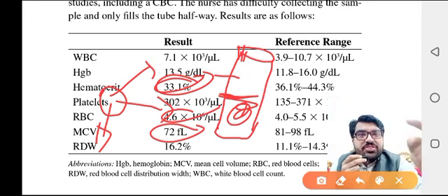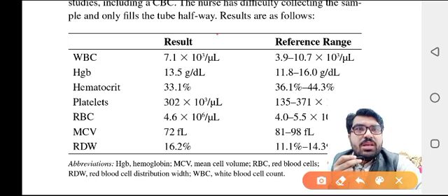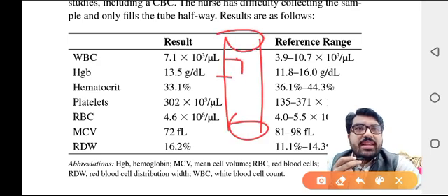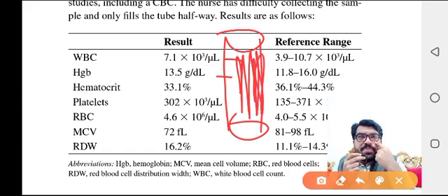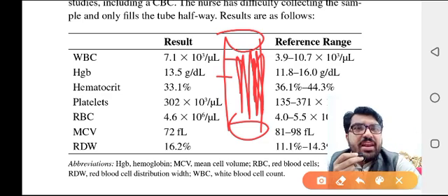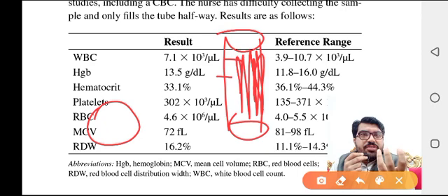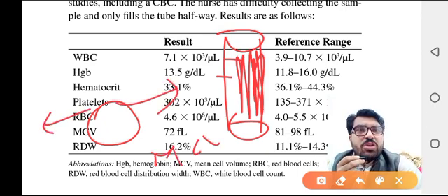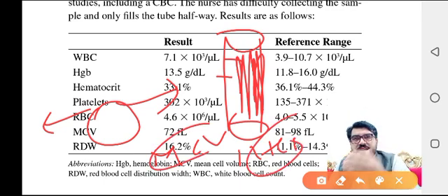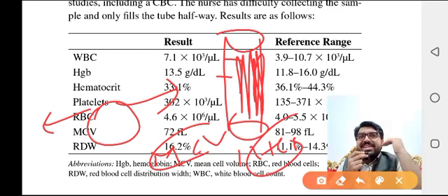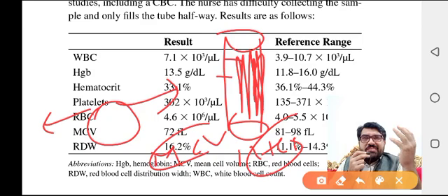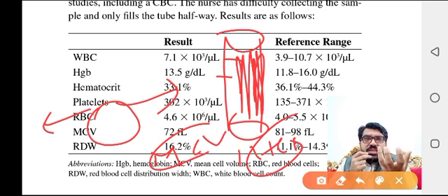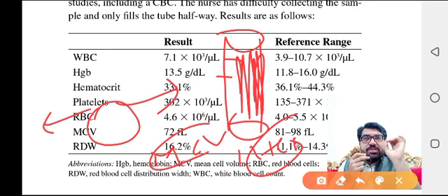Now, if you take more blood than the mark in the EDTA tube: in this case, the EDTA becomes diluted — its concentration falls. The diluted EDTA cannot maintain the RBCs in their normal size or shape. As a result, the RBCs swell — the MCV becomes higher than normal. If MCV is more, hematocrit is also more. This creates a spurious macrocytosis artifact.